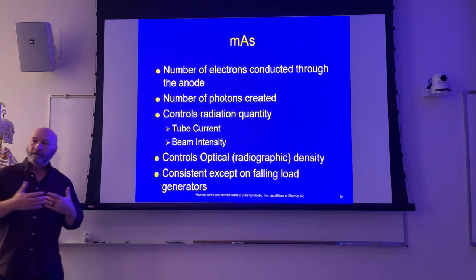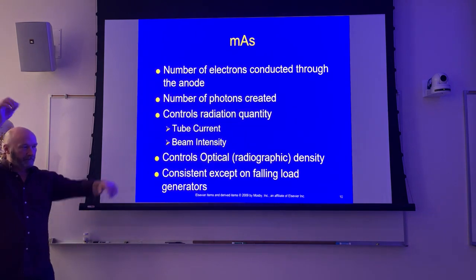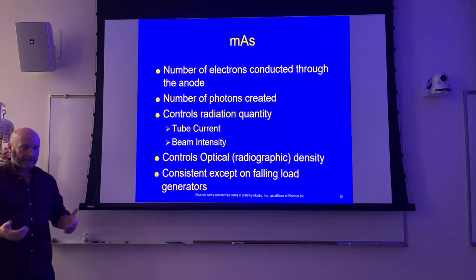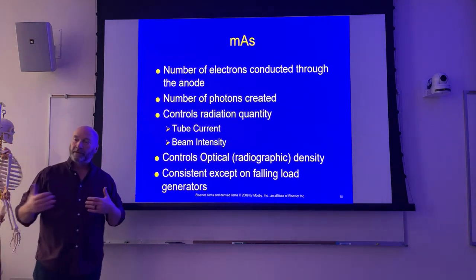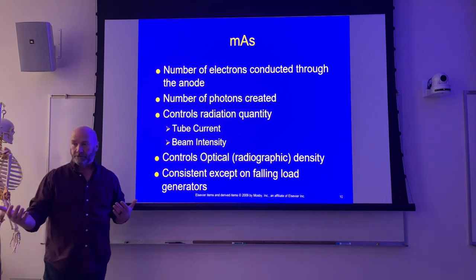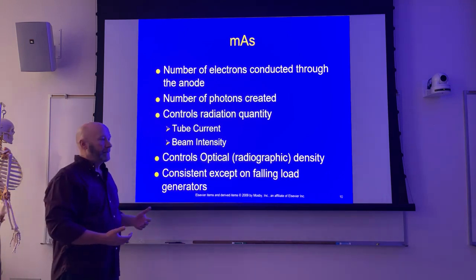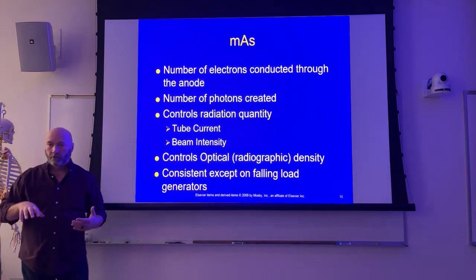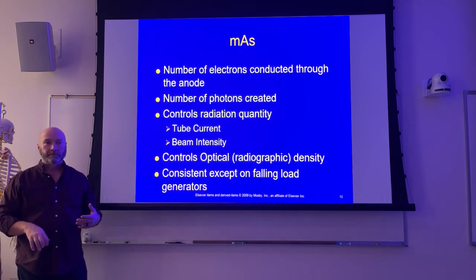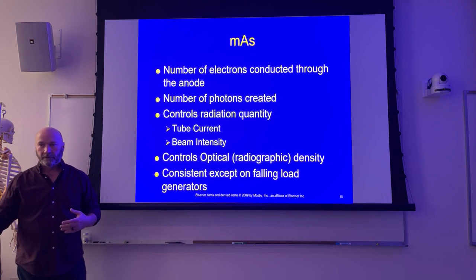So you have a patient, right? So you have an asthenic patient, and then you have a hypersthenic patient right after that. Theoretically, what you should be doing is, because primarily what you've changed there is adipose tissue, soft tissue, then the patient's going to absorb more of that X-ray beam. So if they absorb more of that X-ray beam, what do you need more of?